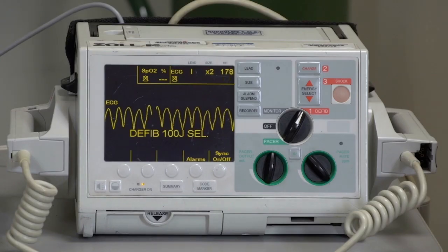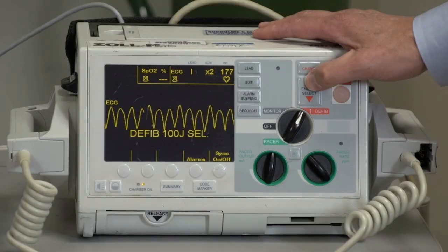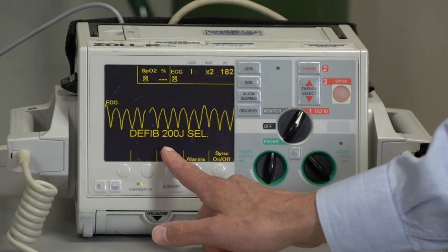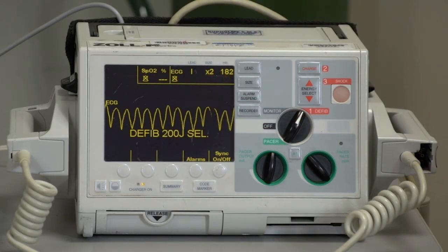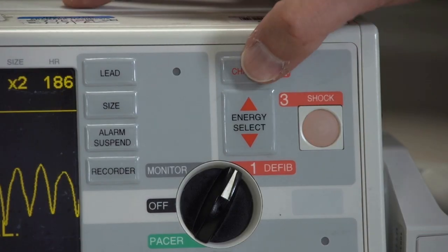With a manual defibrillator, you must first verify that the rhythm on the monitor shows ventricular tachycardia or ventricular fibrillation. Continue CPR while you select the appropriate current level. For a biphasic machine, use the manufacturer's recommended energy level, or, if this information is not available, the maximum energy level. For a monophasic machine, use 360 joules. Press the charge button.